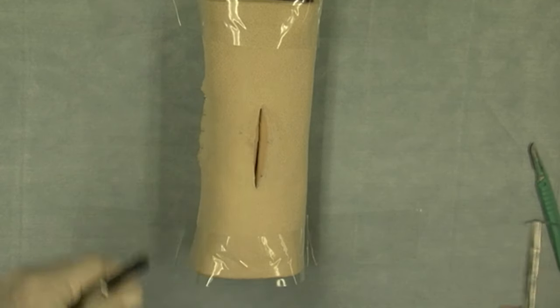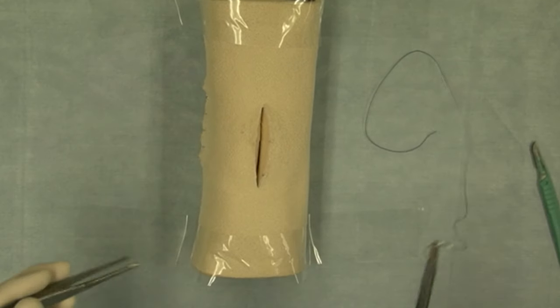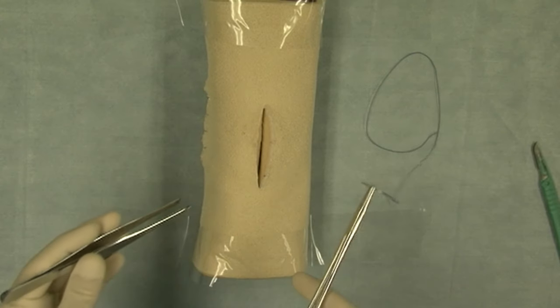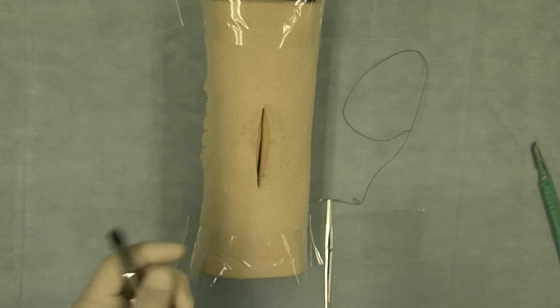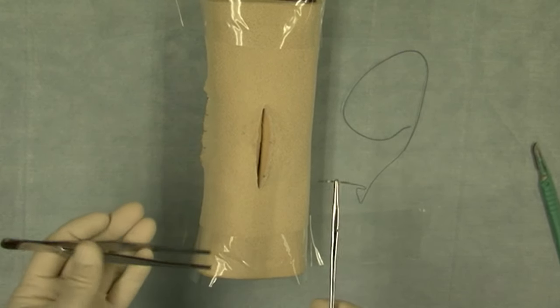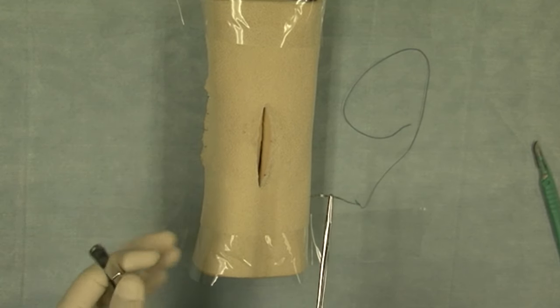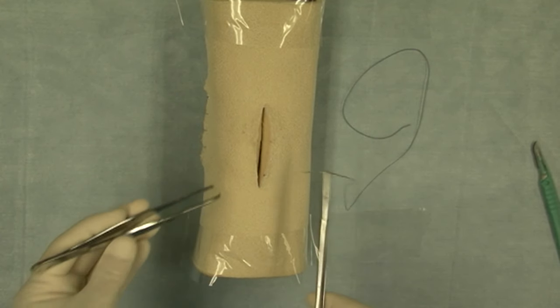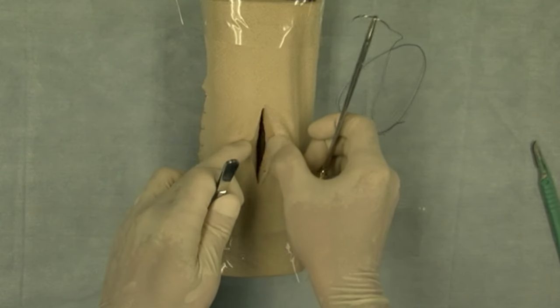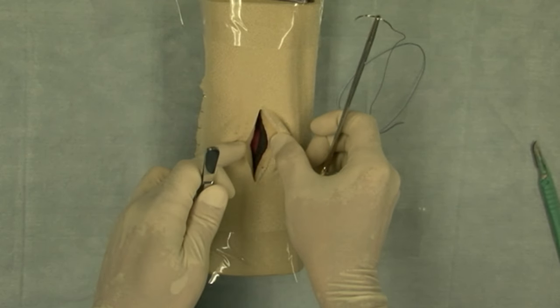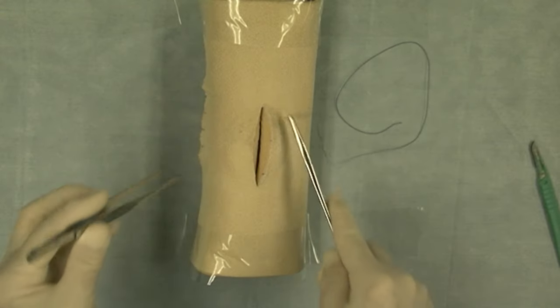I'm going to demonstrate the cruciate suture pattern, or what some call the cross mattress suture pattern. This is used generally under conditions of tension, primarily for skin closure. Notice that I'm using the skin portion of the daisy. You can see there's somewhat of a gap here; this is the skin portion.